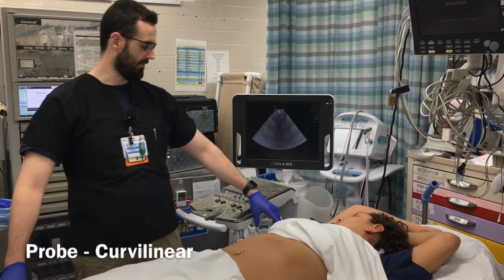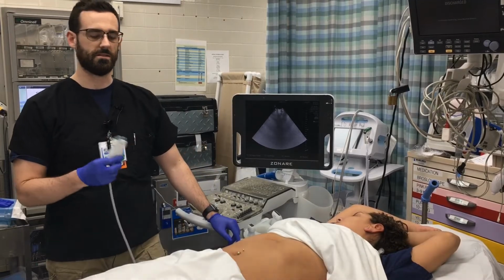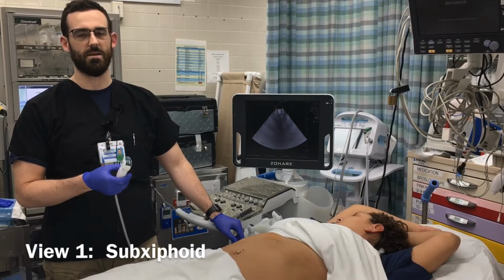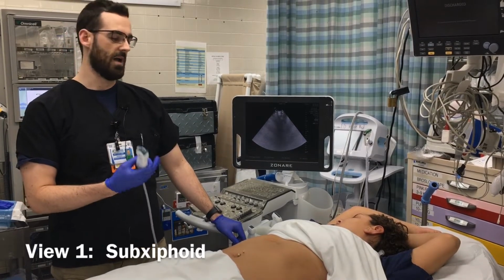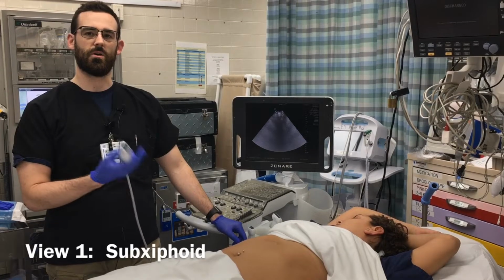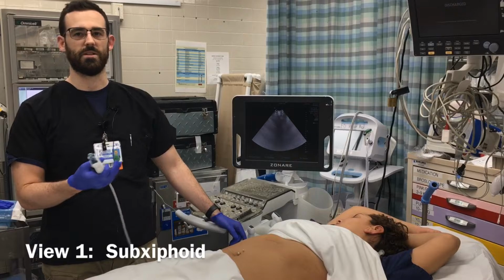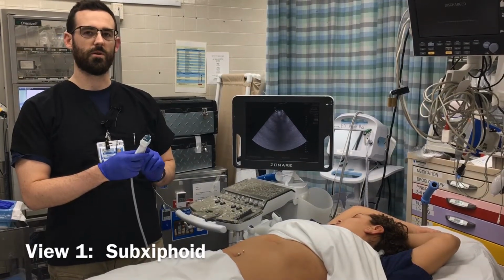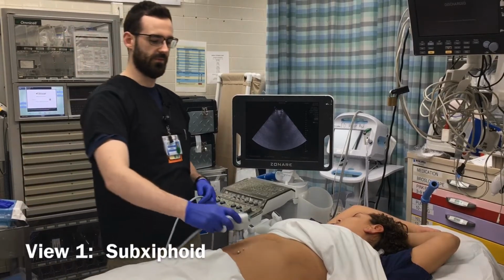Okay? So today we're going to use the Zonare, and we're going to use our curvilinear probe, which is good for distance. And the first spot we're going to go to is called the subxiphoid space. And I like to start there just because if someone has hypotension and they have a pericardial effusion, it's usually something that you can take care of right away with a needle decompression. So what we're going to do is you're going to always make sure the probe marker is to the patient's right or your left, and you're going to go in the subxiphoid space.